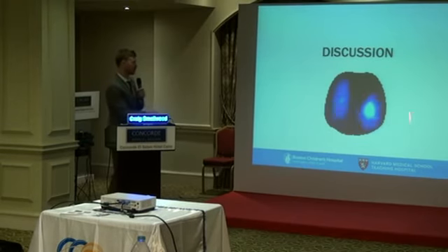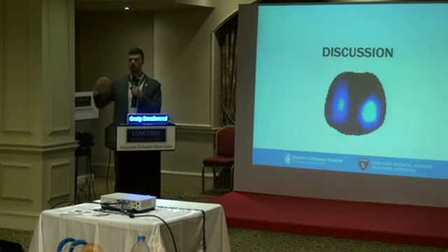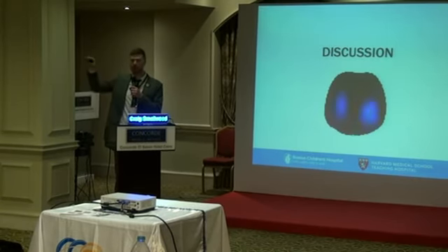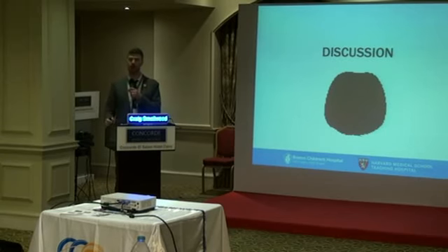So you would look at this peak inflation, and if we take a snapshot right now, and then the next day take another snapshot at peak inflation, we'd be able to look at differences, and you would colorize that typically with orange or blue. That's just the convention in the EIT literature, and I have some data to show you this afternoon. But I think that's what you're asking for, such that when you're a clinician you could come in and see not the actual lung image, but you would say in the upper left there's an orange part that is representative of a decrease in ventilation in that region compared to your baseline image, and so you can do that.